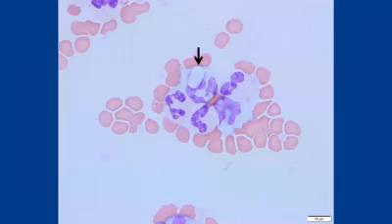So then I got a blood film, and this is actually at the feathered edge of this patient's film, all right? So not the best place to do white cell morphology. This is a neutrophil, this is a neutrophil, this is a neutrophil, here's a monocyte, and then this one, like, I can't 100% tell. There's some argument whether or not these are inside of monos or neuts. So I'm not going to go there, but let's pay attention to what we're seeing here.